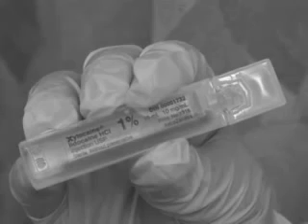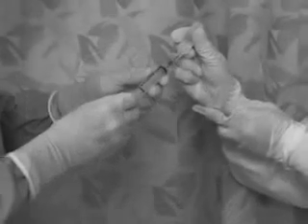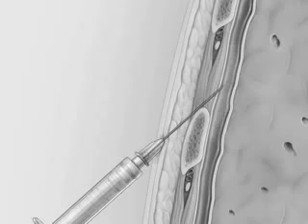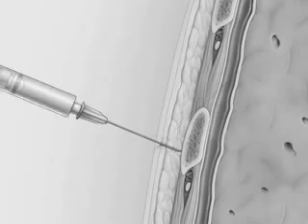on the patient's skin. Cover the field with sterile drapes so that only the procedure site is exposed. Adequate analgesia is a very important step in this procedure, as chest tube insertions can often be very painful for the patient. The skin, subcutaneous tissues, deeper tissue layers, parietal pleura, and periosteal surface of the rib below the intended insertion site must be generously anesthetized.